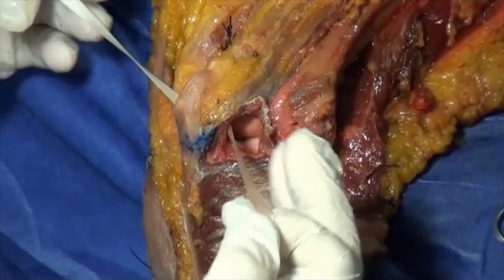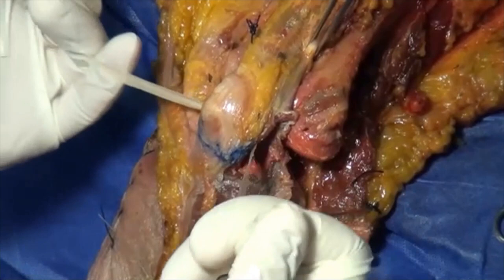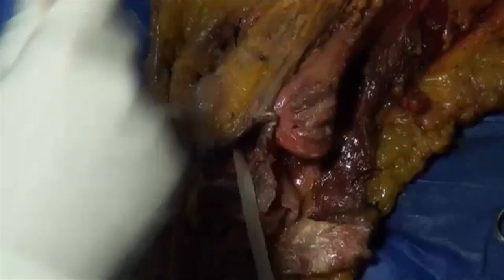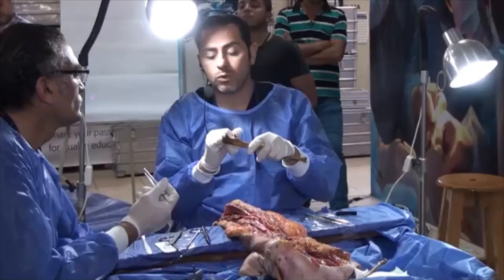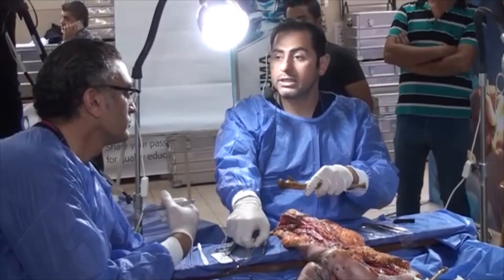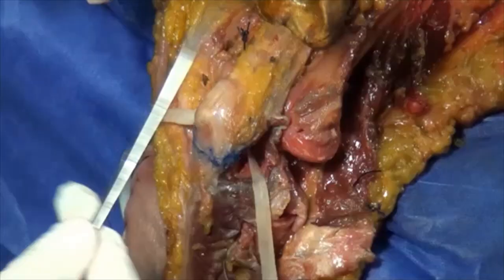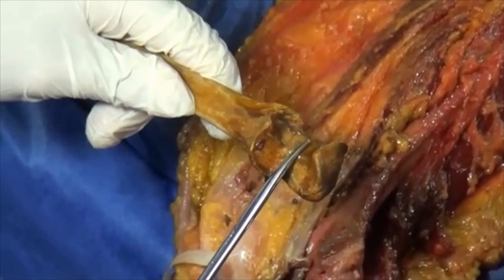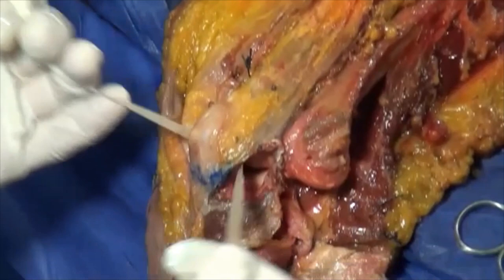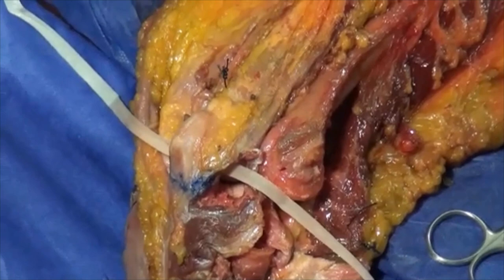Dr. Cameron mentioned a useful trick: place a tape inside the trochlear notch intra-articularly. When you bring the tape forward and backward, it will settle exactly where your cut should be. You can mark the cut precisely — you don't want too small or too large a piece of olecranon, you need the proper size. Mark this with a marker.